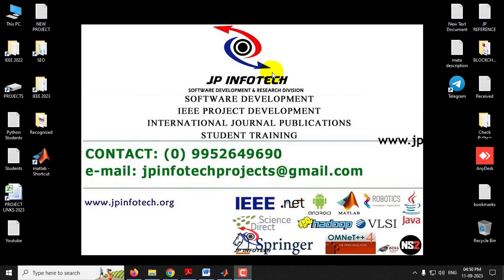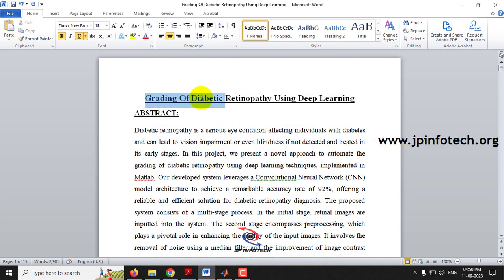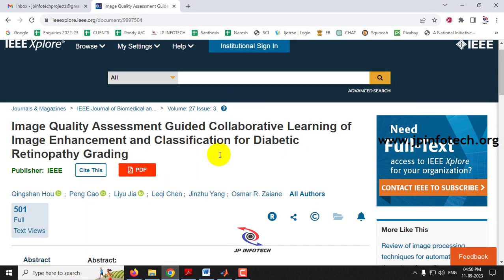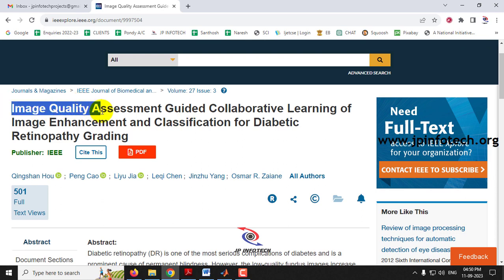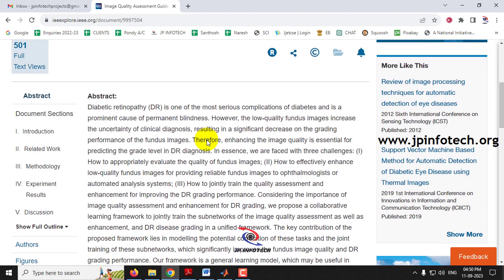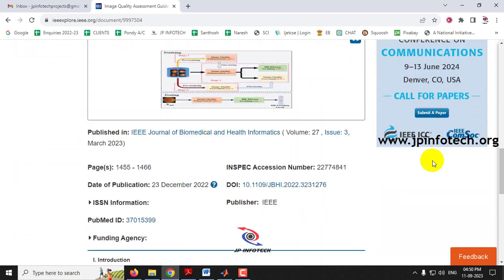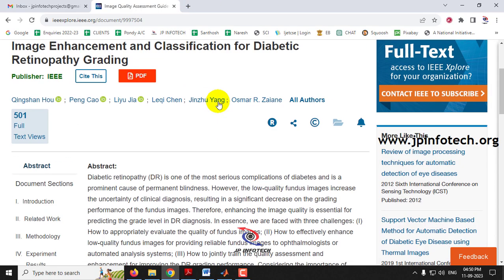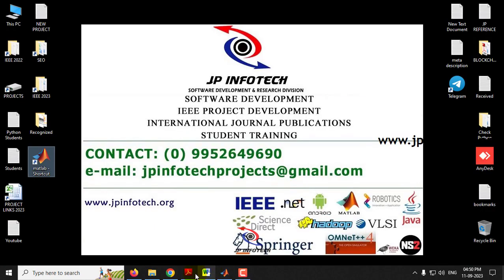In this video we want to see a MATLAB project entitled 'Grading of Diabetic Retinopathy Using Deep Learning,' which is an enhancement from an IEEE-based paper titled 'Image Quality Assessment Guiding Collaborative Learning of Image Enhancement and Classification of Diabetic Retinopathy Grading,' an IEEE 2023 journal paper.